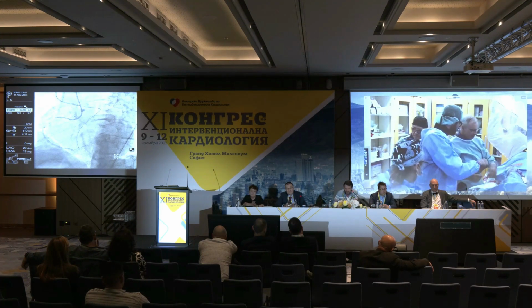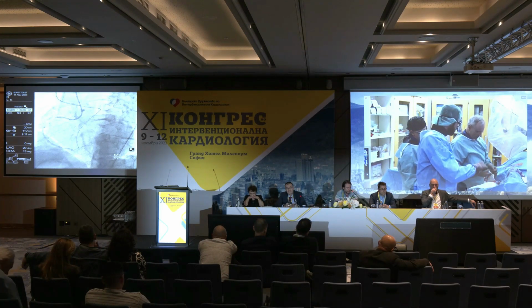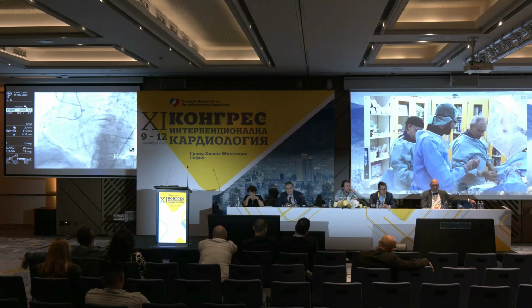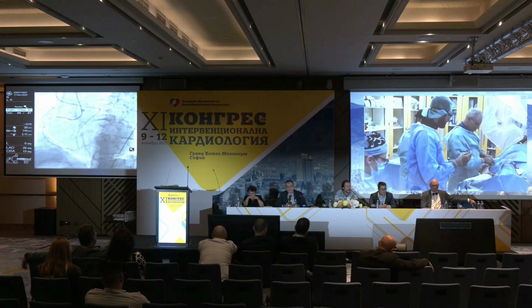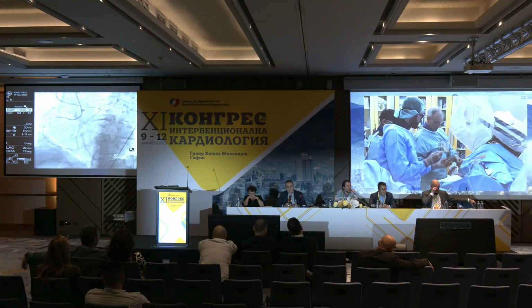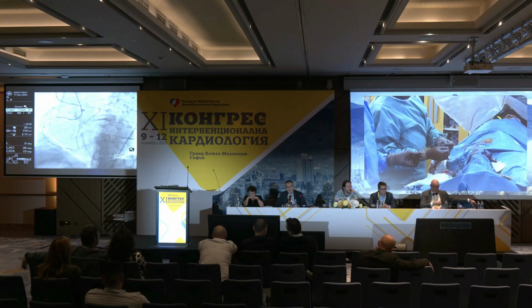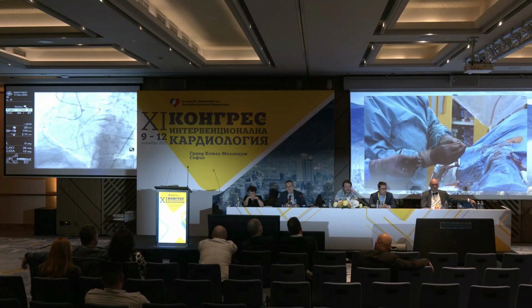The rest, it doesn't. And we have done exactly what you suggested, but with a marker wire, so you don't give unnecessary contrast, because the procedure after retrograde wiring can be zero contrast. But you crossed after antegrade Carlino. I'm just joking.